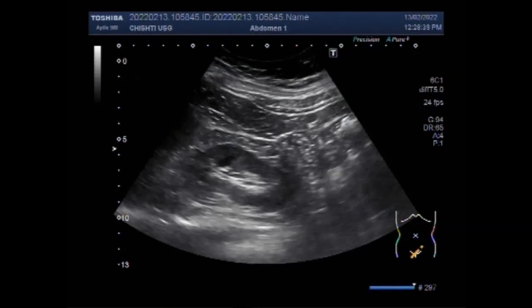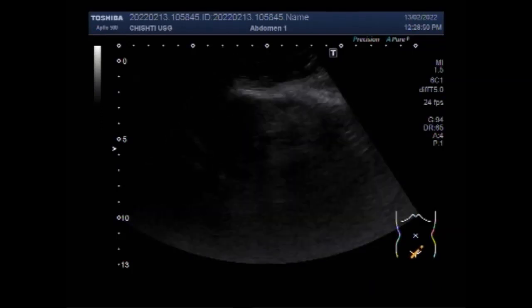Dear viewers, I hope you are all fine. This ultrasound video shows two types of ovarian cysts: one is the hemorrhagic ovarian cyst and the other is a simple ovarian cyst.